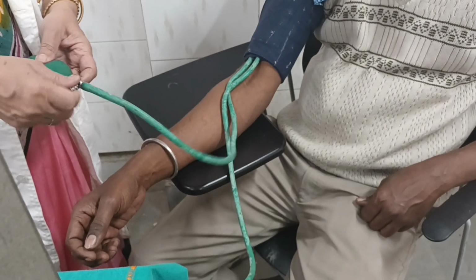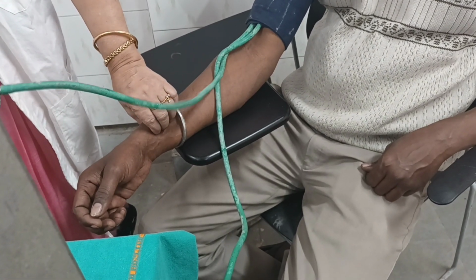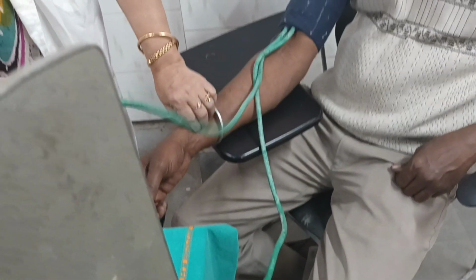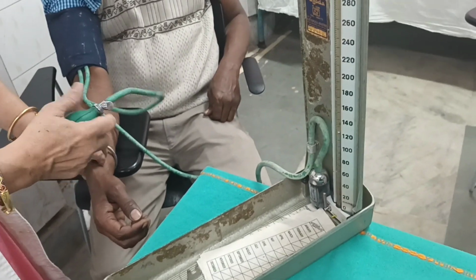Now first, I am going to the palpatory method. By the indirect method, we will measure the blood pressure of the subject, lateral pressure, diastolic and systolic both. First, we will measure it by the palpatory method. Now what will you do? In the palpatory method, we first feel the pulse. Then you raise the pressure until the pulse disappears.